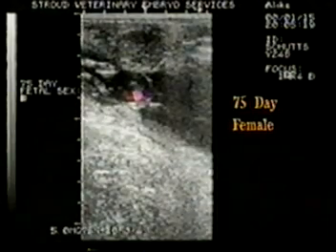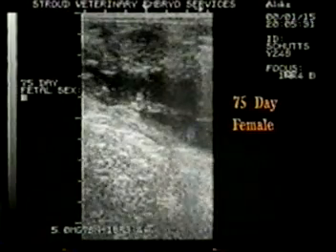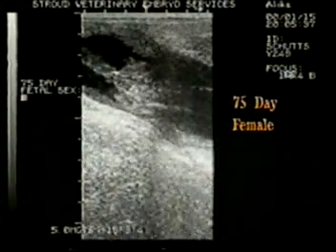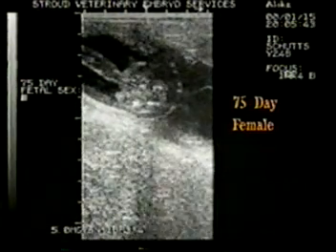The red highlighted area shows the female GT. It appears trilobed in this view. The ultrasonographer will have more difficulty getting a good view of the female GT as compared to the male, due to the anatomical location of the female GT. Consequently, it usually takes longer to sex a female fetus, simply due to manipulating the transducer to get a good view of the perineal area.